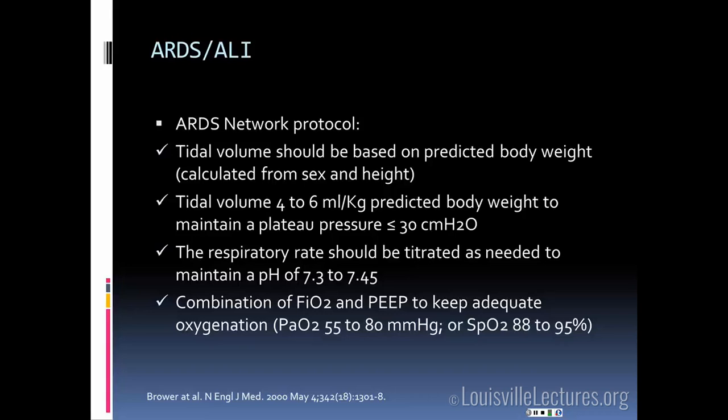They have low compliance, you're ventilating, then with low tidal volume, the dead space is increased. They're going to retain a lot of carbon dioxide. So you need to ventilate these patients typically with a respiratory rate of 24, sometimes 28. And what you want to do is just keep your pH above 7.3. That's the ARDS protocol. Here in the ICU, you like to keep above 7.25.